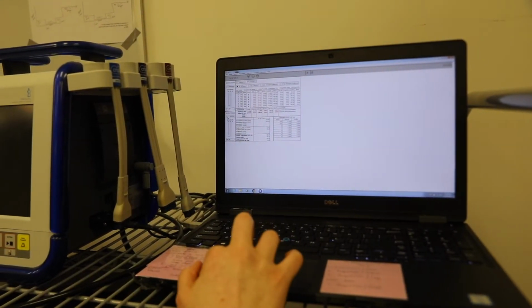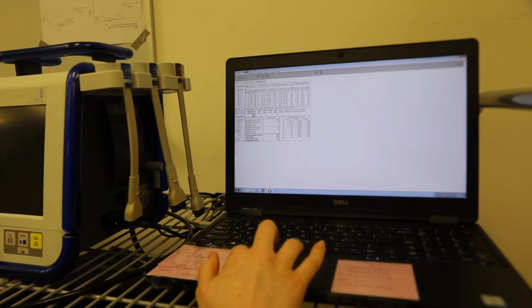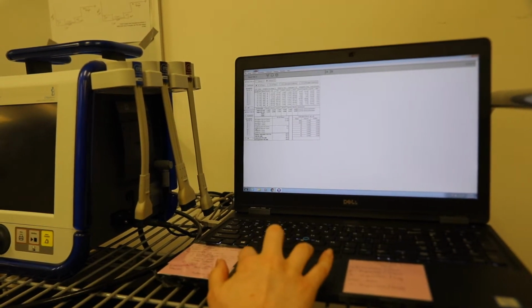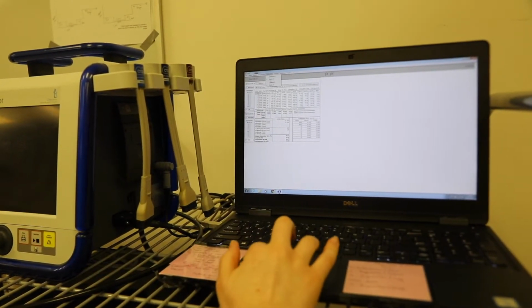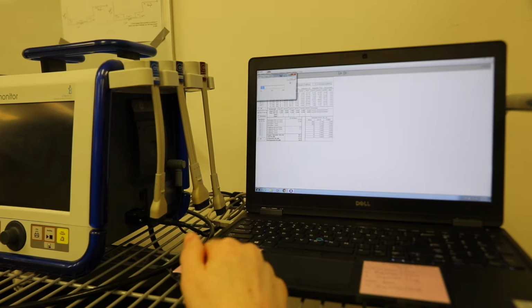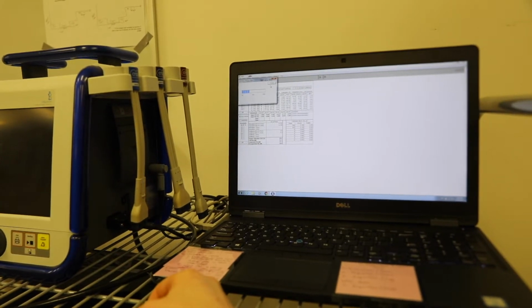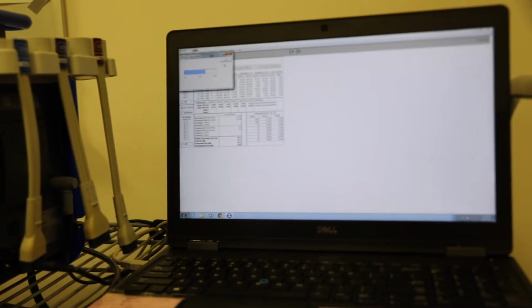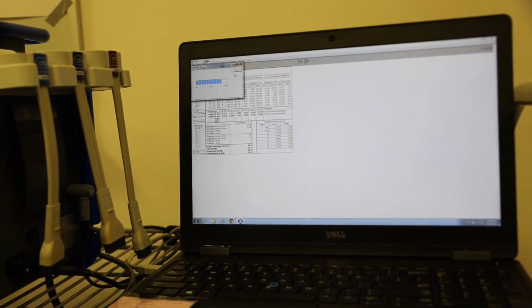But then we also have to hit the auto bias button for it to start to increase the sensitivity, so it'll actually pick up the absorption and scattering numbers. Now that the bar is in the middle here, we know that it's on and it's working. To calibrate, we want to come up here to calibration at the top, and we want to choose to calibrate B, or probe B. Now as we're still pressing firmly on the block, this bar will fill up with blue bars to do the full calibration. And if blue bars aren't coming up in this window, then you're probably not pressing firmly enough.